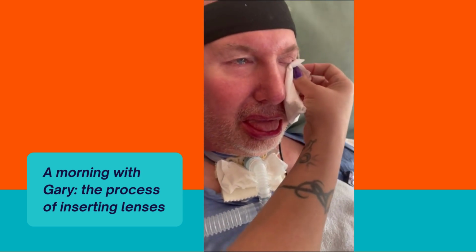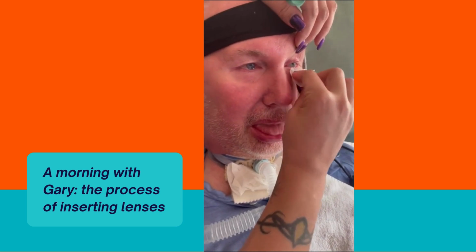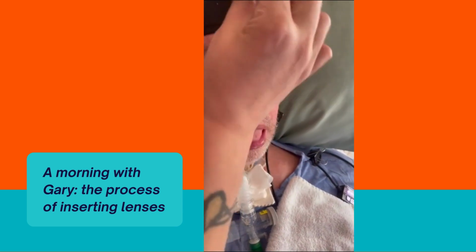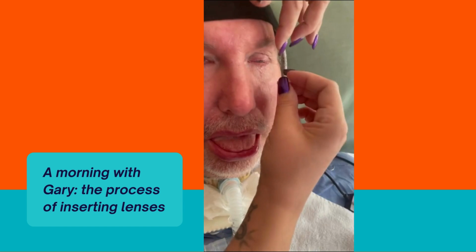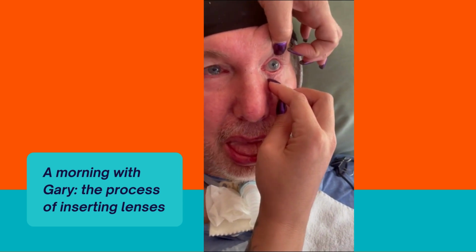She's going to dry off any liquid that's come out. She's going to let him relax for a minute. Now, show me where you want the dots. This is your placement of your dots. And this is why I place it the way I do. Look down, Gary.